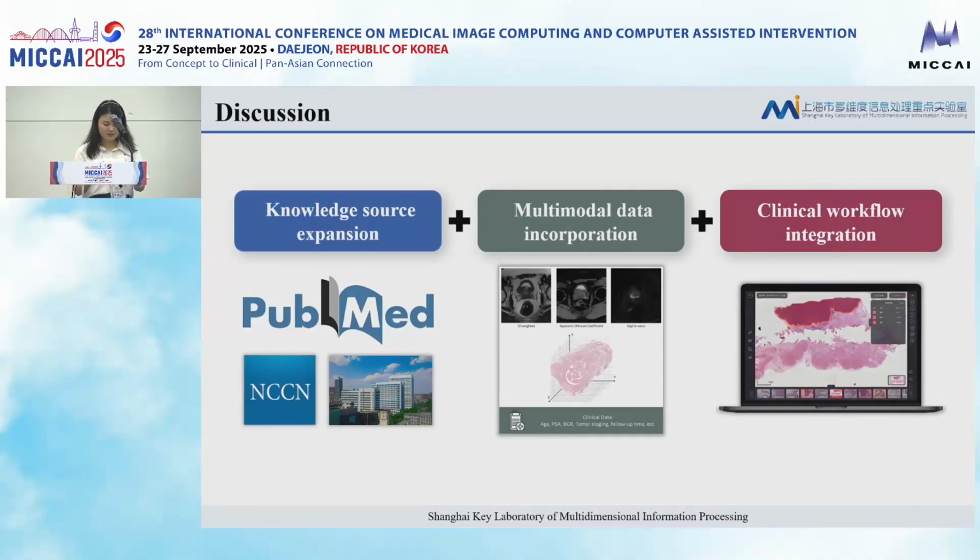Although our proposed dual-branch framework improves the performance of pathology report generation, there remain many directions for future extension. First, the knowledge bank we currently use for retrieval is derived from pathology reports in the training set, which limits the scope of pathological information it contains. This restriction particularly hampers generation when applied to multi-center datasets.